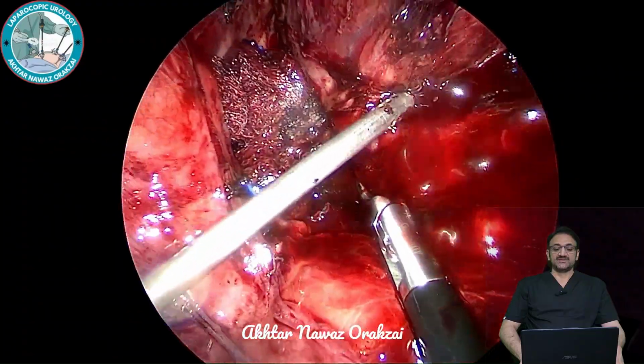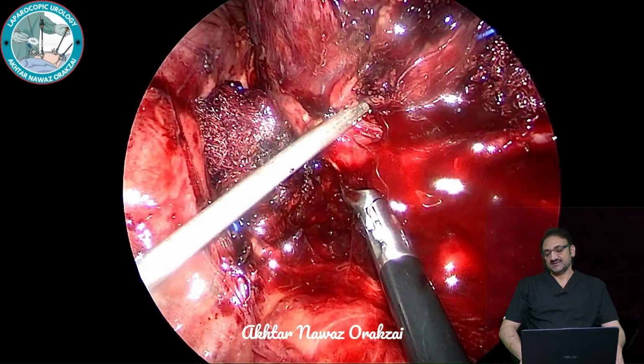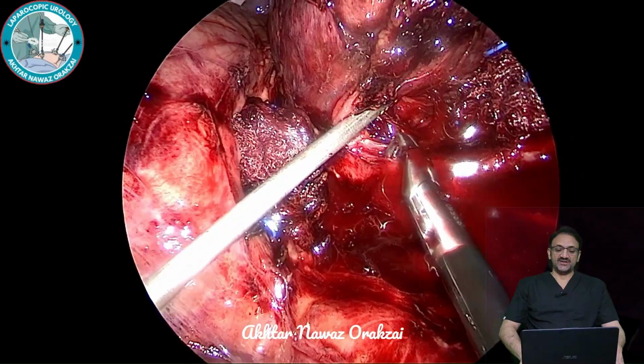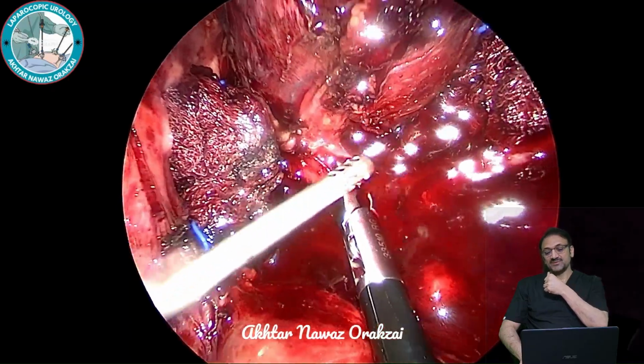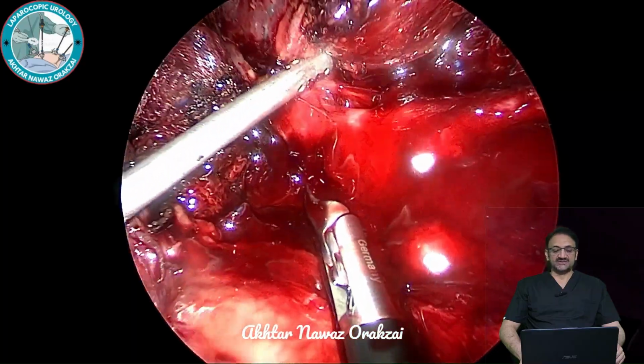So in the continuous oozing environment, I have decided to separate this main adrenal vein from the renal vein and try to clip it and then cut it so that I can quickly mobilize the adrenal gland without injuring the renal vein.